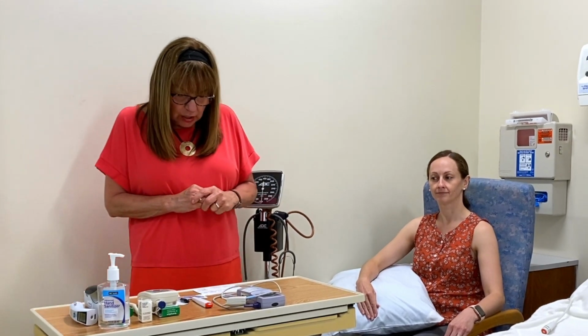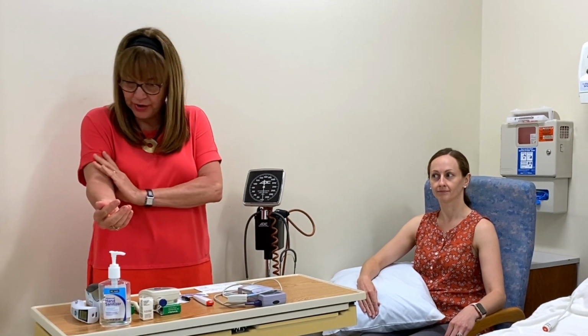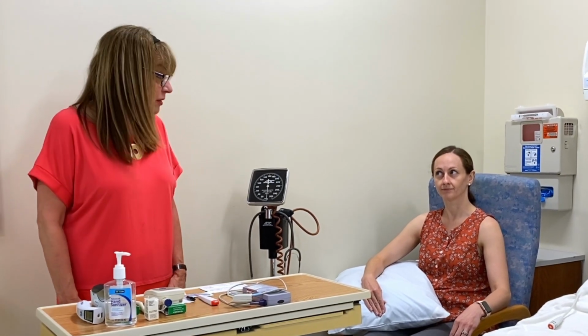Now, when we talk about blood pressure, there's a variety of ways that we can measure it. We can measure it traditionally brachially, right here over the brachial artery. We can also measure it radially. If for some particular reason the patient doesn't have any extremities, then we can certainly measure it over the popliteal area. And I've also seen it over the posterior tibial artery as well.